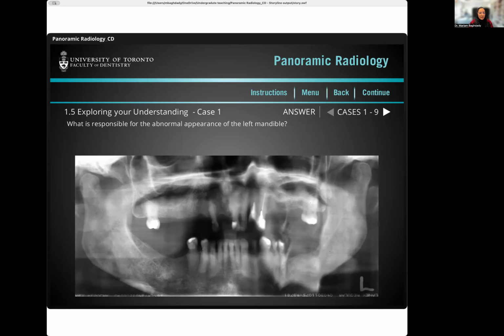Any other opinions? I don't know where the chat went, actually, to be honest. Where'd my chat go? You guys actually don't put the chat because I can't see the chat box. Okay. Any other opinions? Oh, I have a chat here. Okay. Any other opinions? Patient moved.